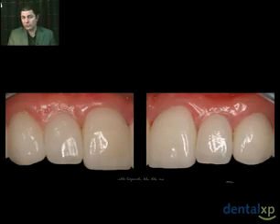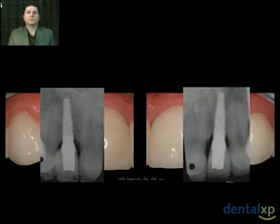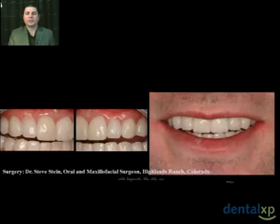So the advantage for Stuart here, where he has all ceramic restorations on his adjacent teeth and an all ceramic implant crown, is that the materials are essentially similar, so metamerism is less of a problem. Here's a view of Stuart's x-rays, indicating excellent implant placement, also showing us that the reason he has papilla is because of the proximal peak of bone on adjacent teeth, not the implant. And now a superimposition of those x-rays on the tooth.